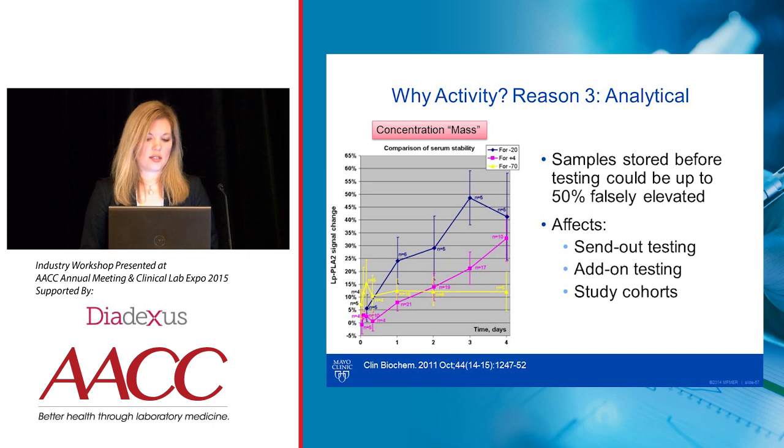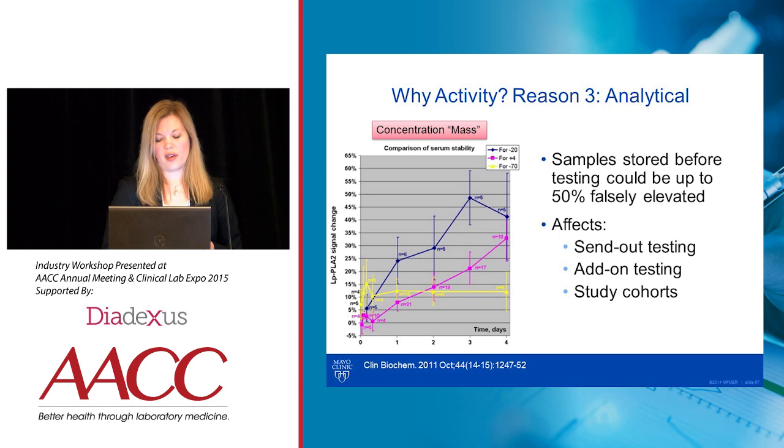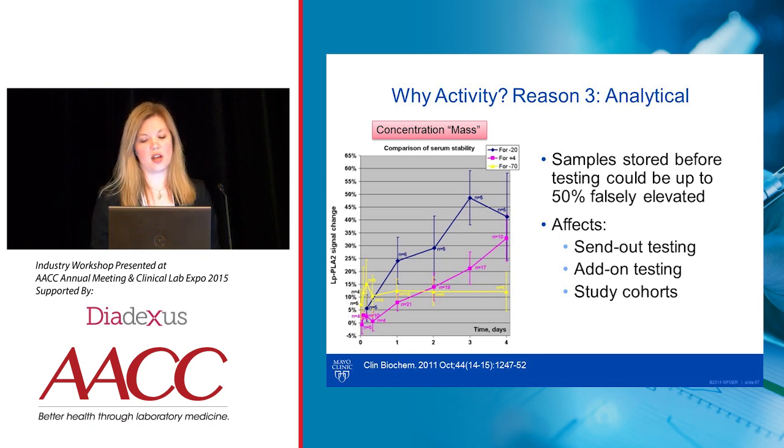The concentration assay, we've shown, this is data from Mayo Clinic shown several years ago, that samples that are not processed immediately can have an increase in the readout from the concentration assay depending on how long the sample is stored. It might be hard to see with the small font here, but the pink data is samples stored refrigerated for up to 4 days.